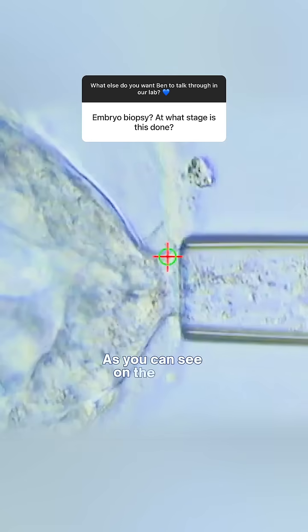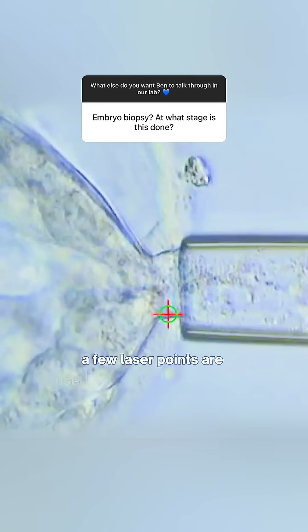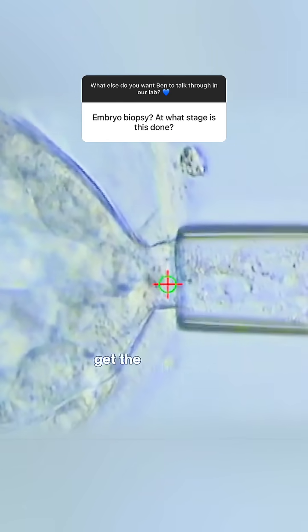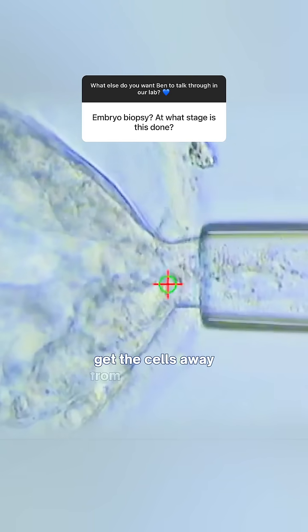As you can see on the video, a few laser points are used to help the embryologist get the cells away from the main mass.